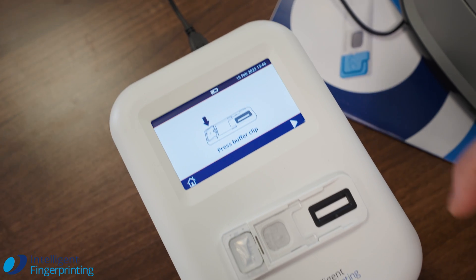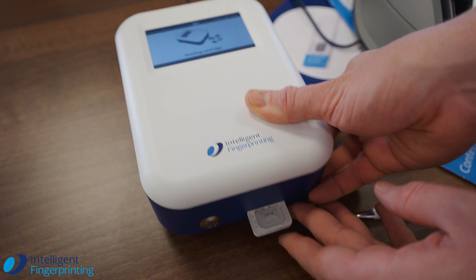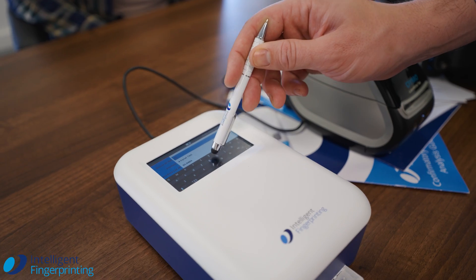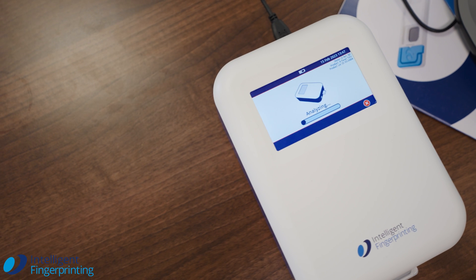Once we've collected the samples, the next step is to analyse them in our reader. The reader is quick and simple to use. You insert the cartridge, which automatically recognises which sort of cartridge you're running and checks things like the time and date. We then move on following the on-screen instructions, pressing the buffer clip, activating the test and waiting 10 minutes for the clear on-screen results.